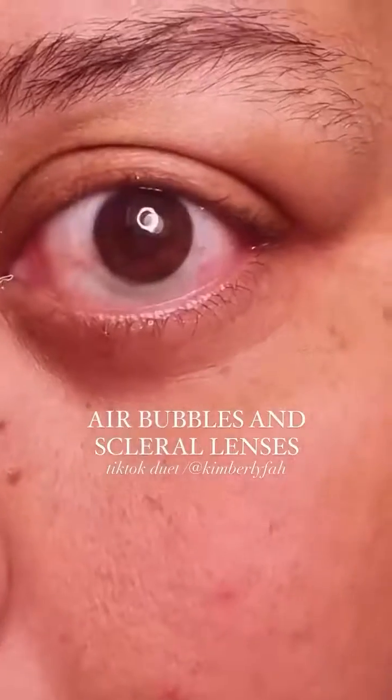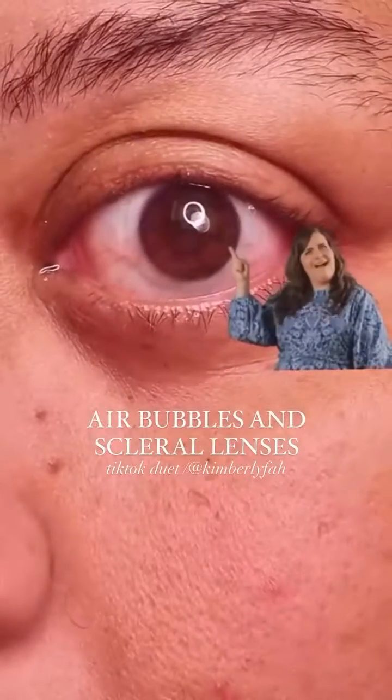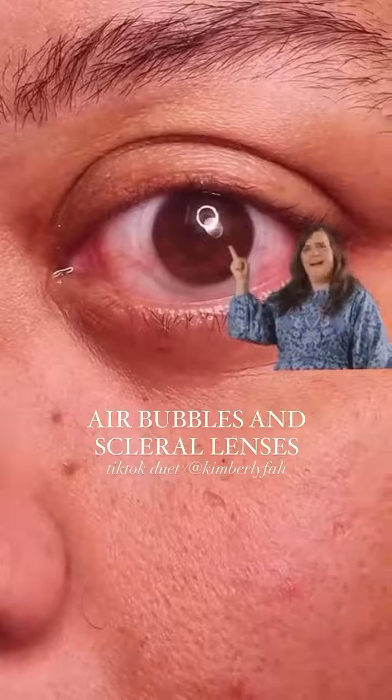My right eye was bothering me shortly after putting my lenses in. I didn't see this before, but you can see that there's an air bubble in there now.